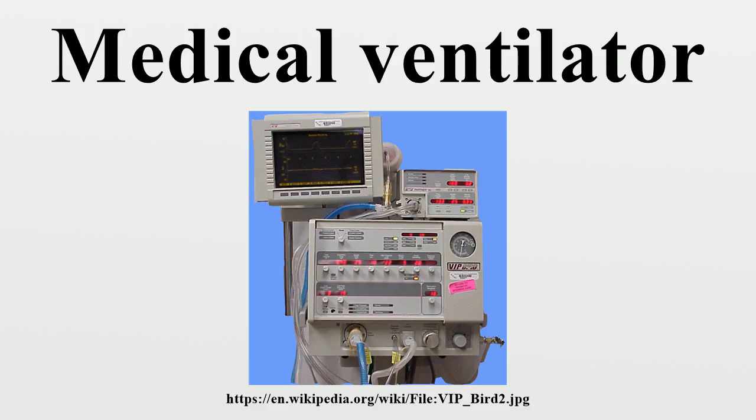Non-invasive methods, which are adequate for patients who require a ventilator only while sleeping and resting, mainly employ a nasal mask. Invasive methods require intubation, which for long-term ventilator dependence will normally be a tracheotomy cannula, as this is much more comfortable and practical for long-term care than is larynx or nasal intubation.